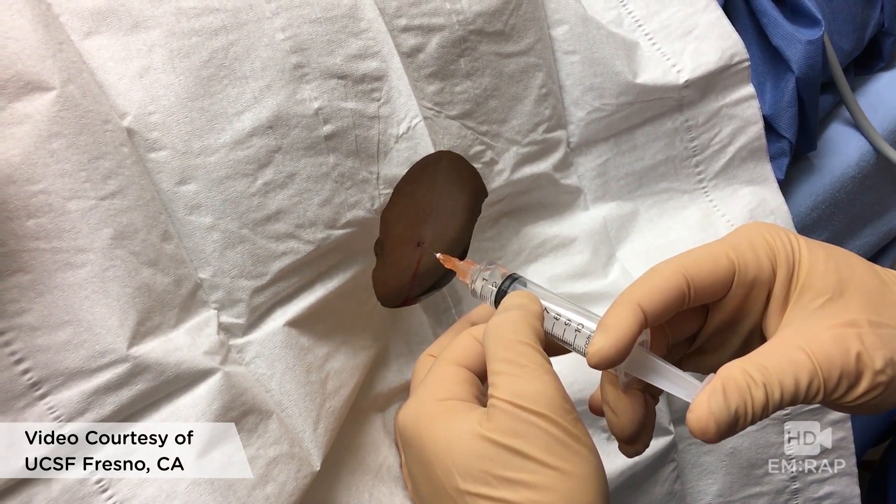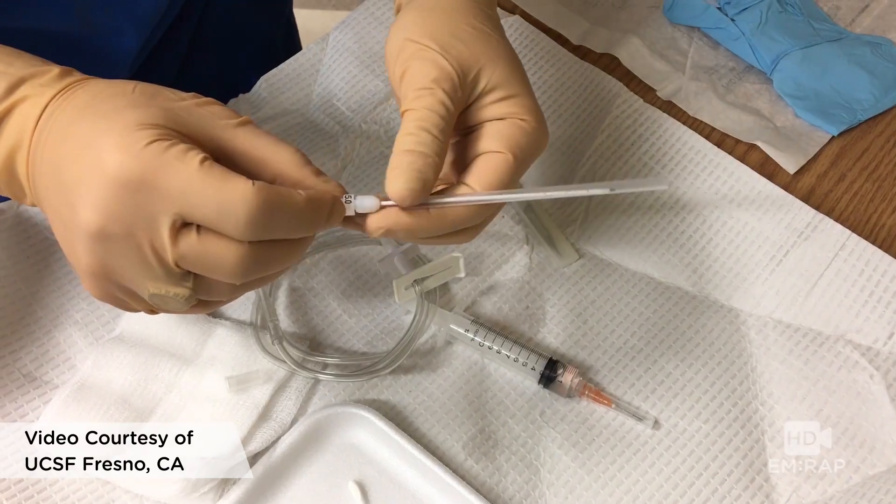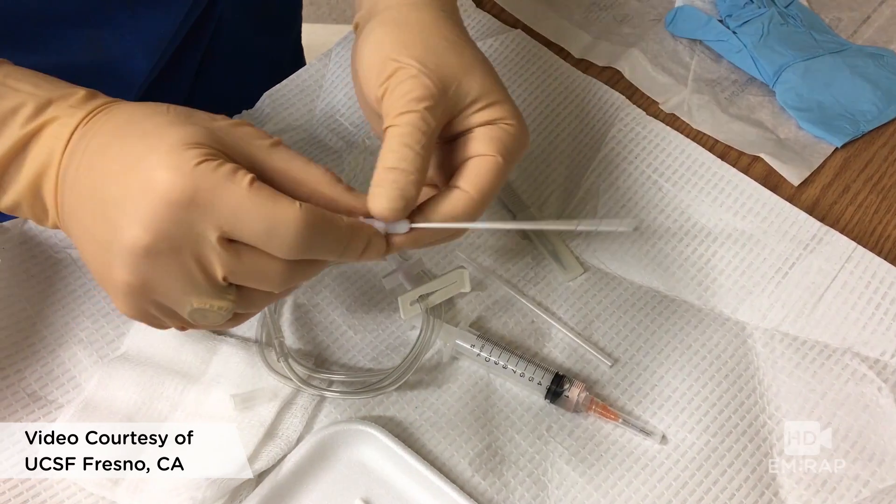Set up your equipment. You should have your tubing, scalpel, and needle with catheter — which, by the way, does not always come in the kit, so make sure you check ahead of time.